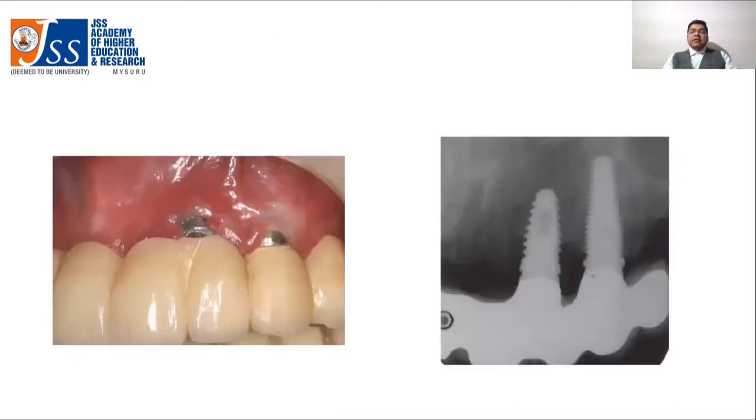On the other hand, unrealistic expectation of reconstituting lost tissue by placing gingival tissue at a greater distance from underlying alveolar bone, such as in the case when implant is apically placed relative to the adjacent teeth, will inevitably lead to future complications. This scenario can arise when the implanted site has been compromised by previous extractions or exposed to long-standing infections. In these situations, bone augmentation should be considered as the part of treatment plan if a stable soft tissue result has to be achieved.